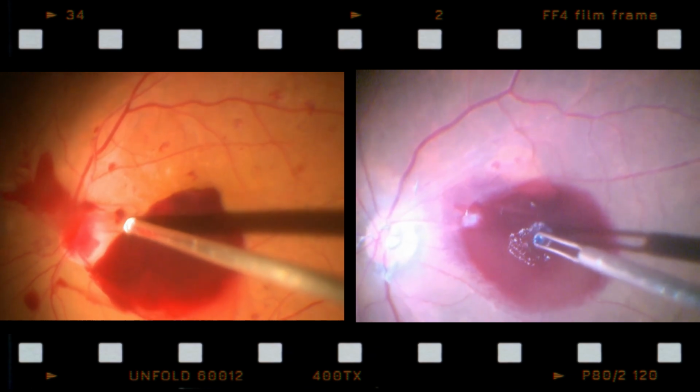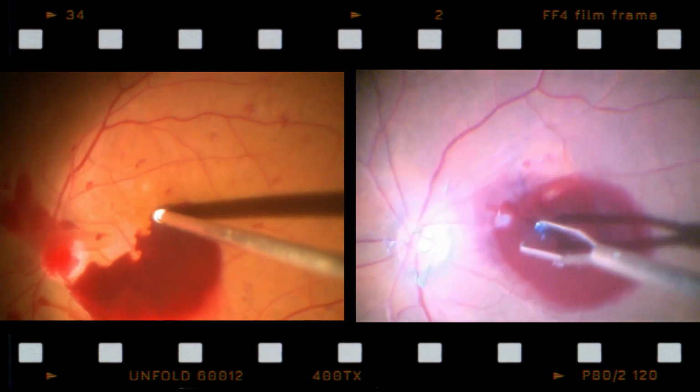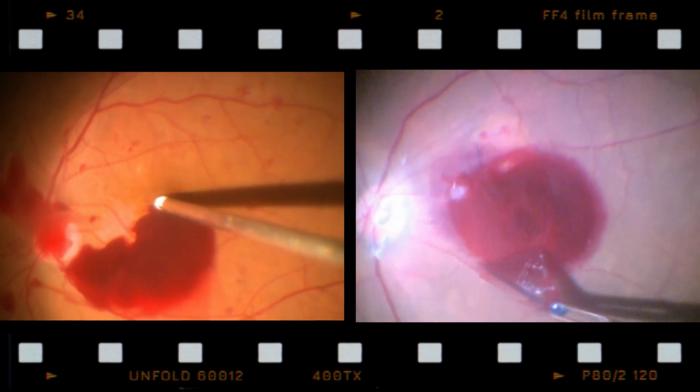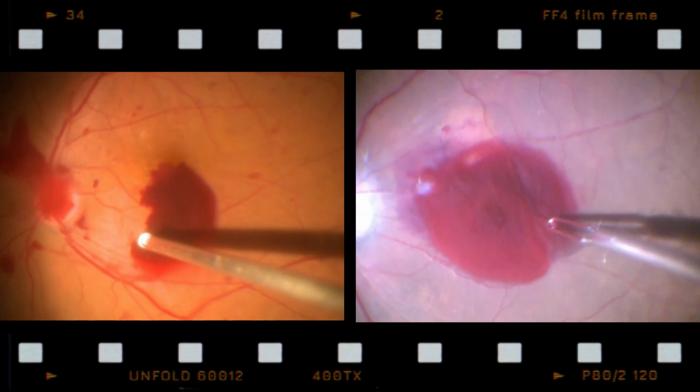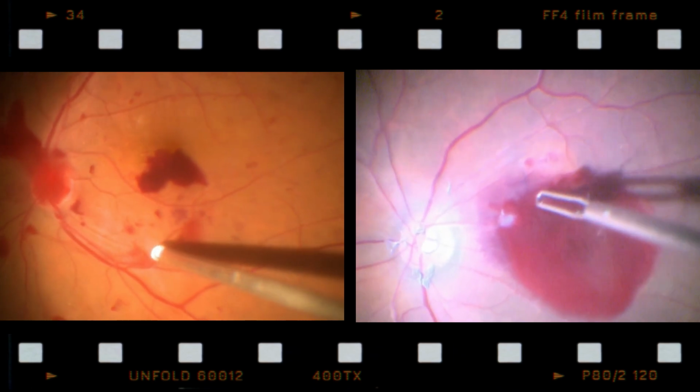These cases demonstrate that the plane of a pre-retinal hemorrhage is not always possible to determine pre-operatively. During surgery, accurate visualization using high magnification allows perfect delineation of the planes to evacuate these hemorrhages.